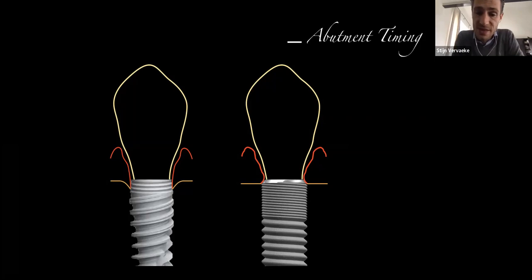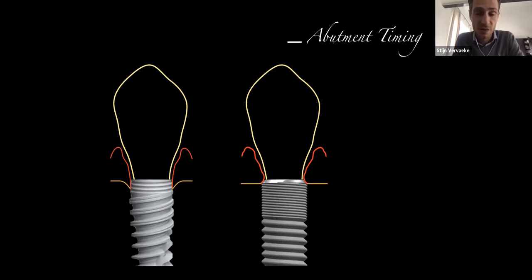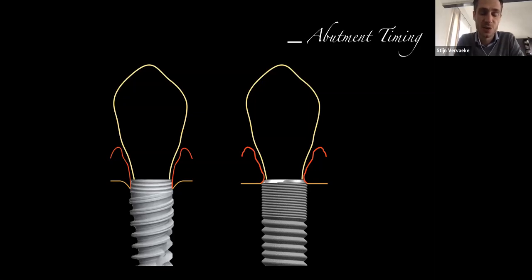Of course, not every implant is the same. So I had a look at a lot of single cases I've been treating with AstraTech EV, and mainly the anterior cases where we work with provisional restorations. The provisional restoration sometimes needs to be adapted quite a few times to place some pressure on the soft tissues, to guide the soft tissues towards the ideal level, for instance, and then it's quite possible that you have to disconnect the provisional crown 3, 4, 5 times before we are happy with soft tissue management.